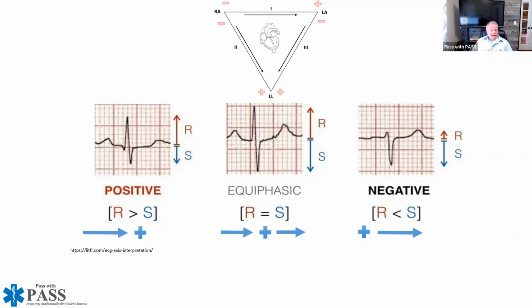And again, there's not a ton of information here that you guys have to study and write down, but I do want to point out a few high points here so that when we're looking at axis deviation, it'll make it a little bit more clear for you.